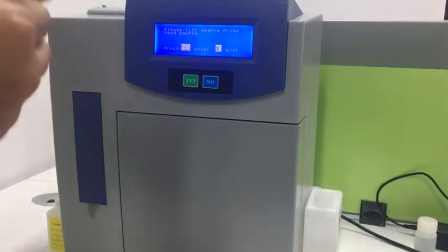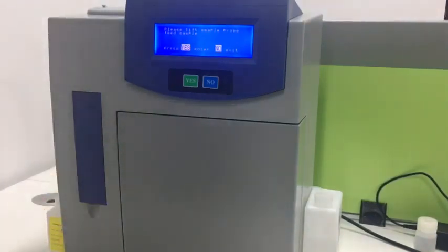Then we can record the results and use a calculator to calculate the mean value, SD, and CV values. This allows us to assess the stability of the analyzer.